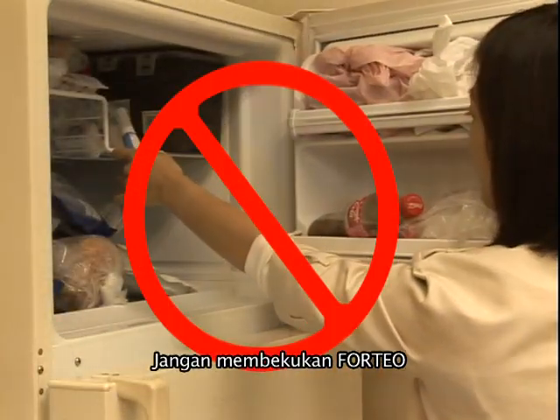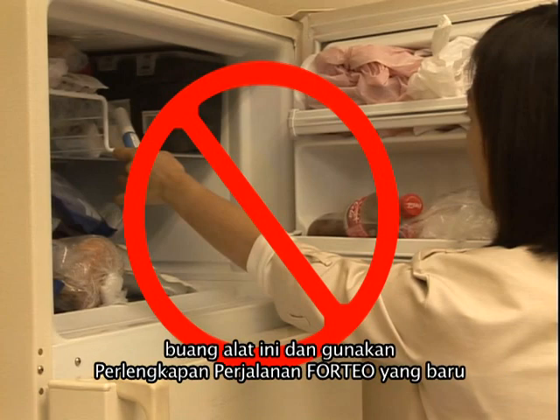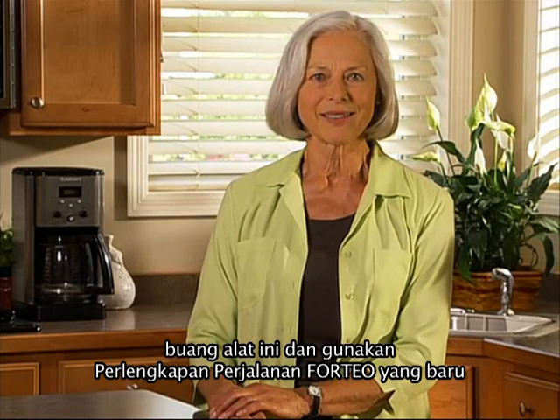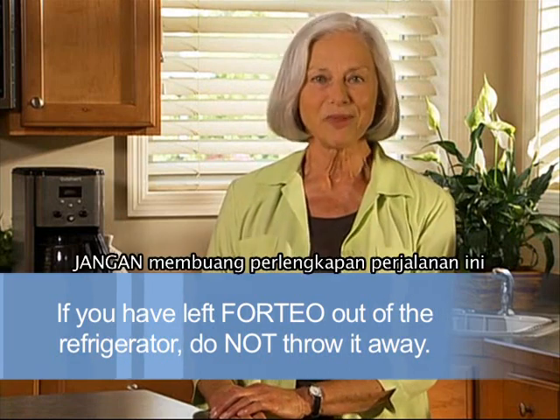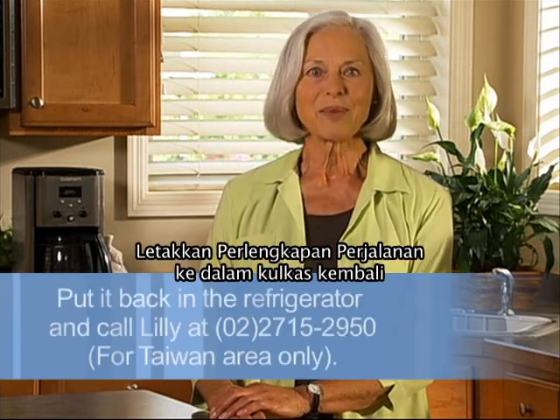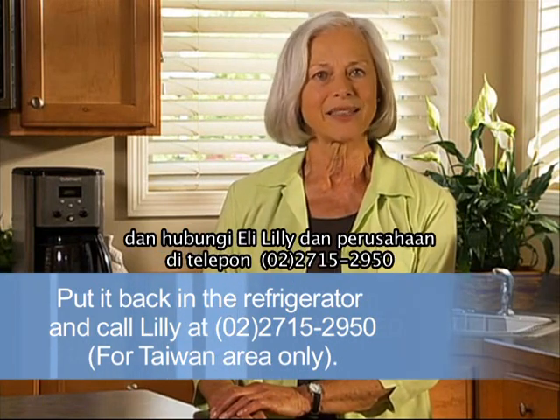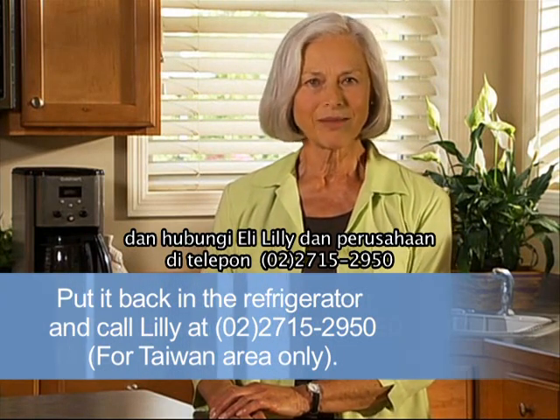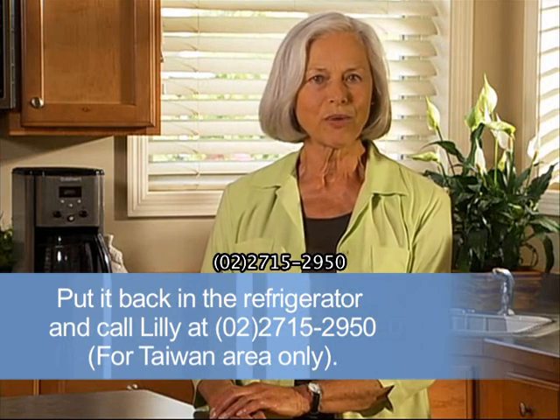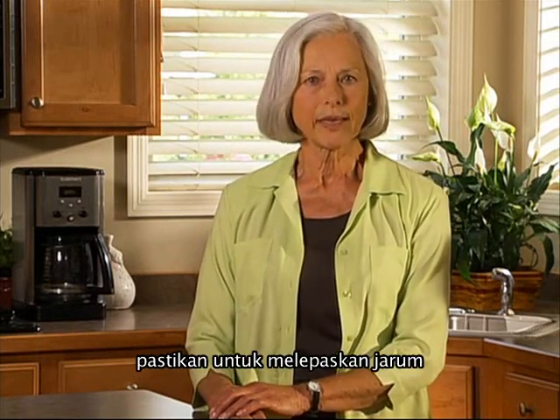Do not freeze Forteo. If the Forteo delivery device has been frozen, throw the device away and use a new Forteo delivery device. If the Forteo delivery device has been left out of the refrigerator, do not throw the delivery device away. Place the delivery device back in the refrigerator and call Eli Lilly and Company at 02-2715-2950. Before throwing away the Forteo delivery device, be sure to remove the needle.